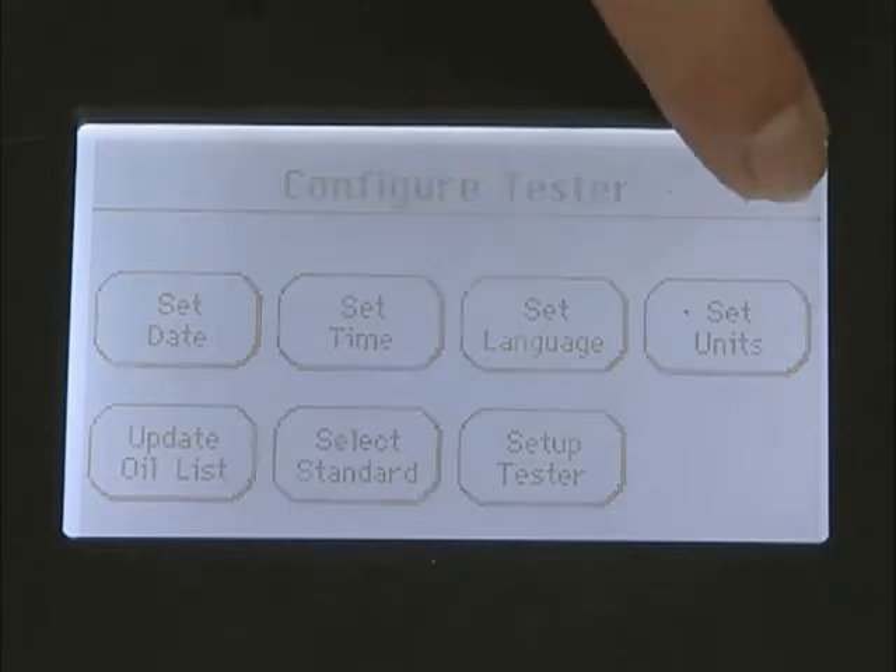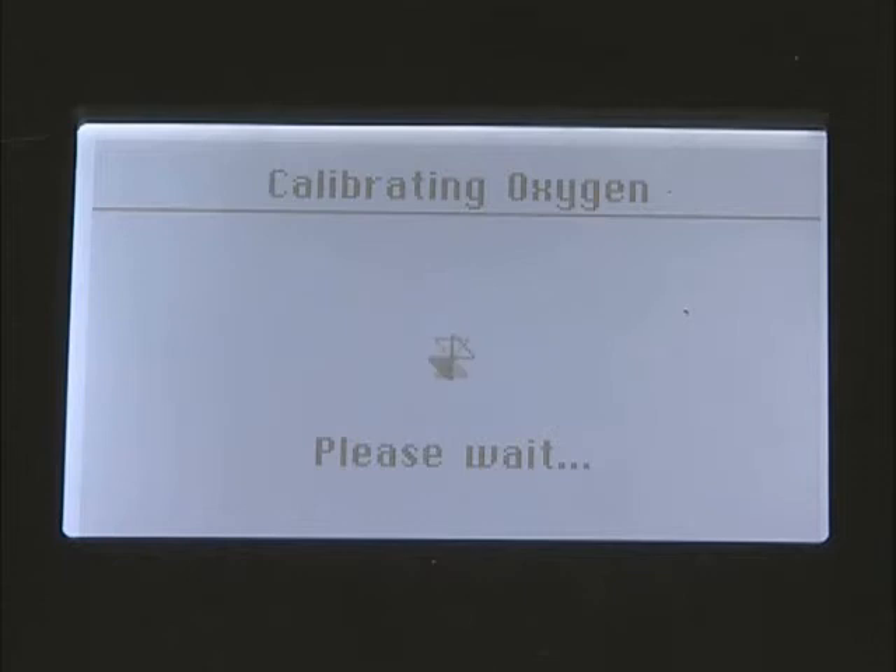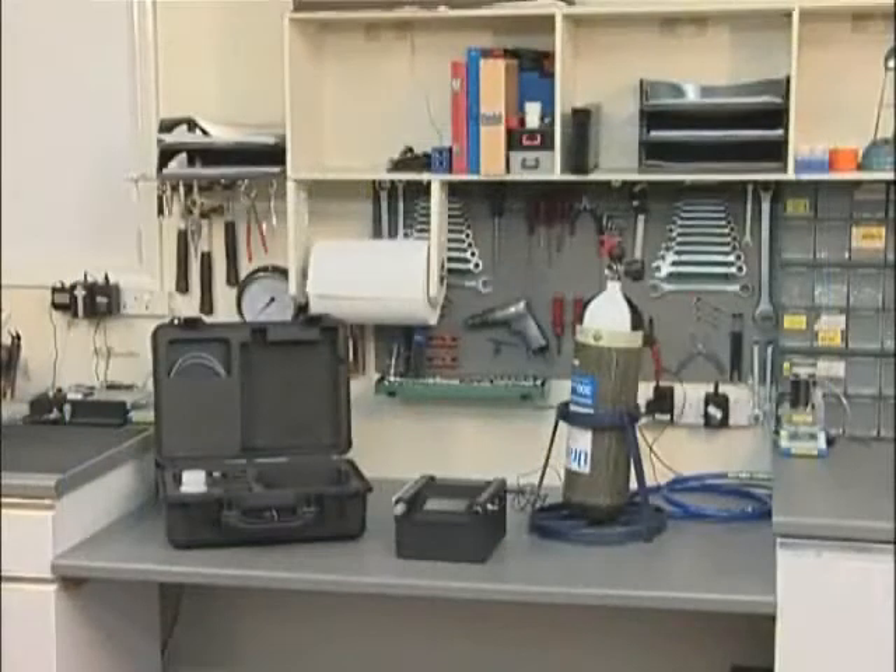To carry out a test, press the begin test button. The unit will then automatically calibrate the oxygen cell against the surrounding atmosphere. The unit therefore needs to be in a well ventilated area.